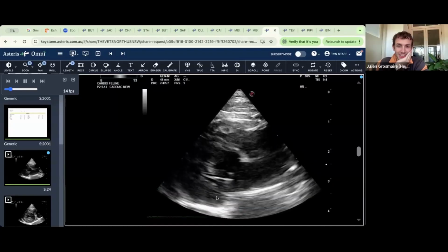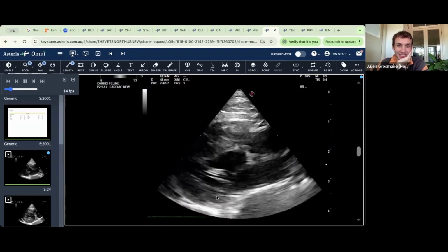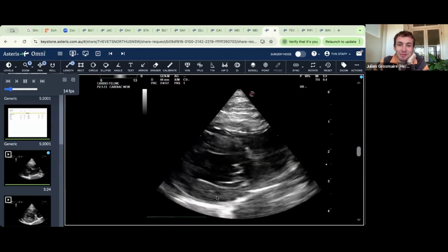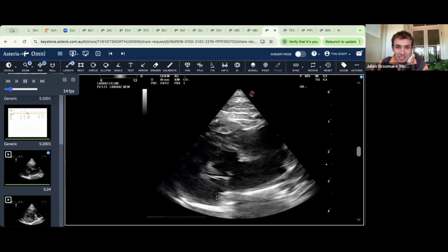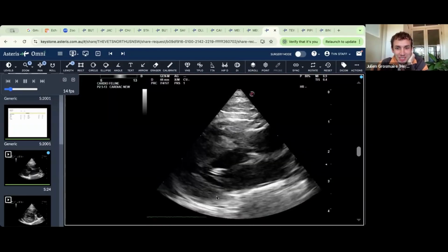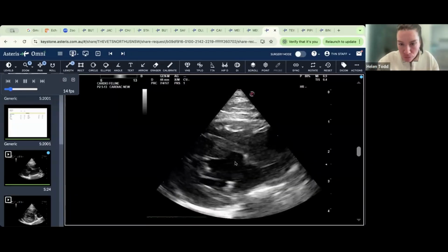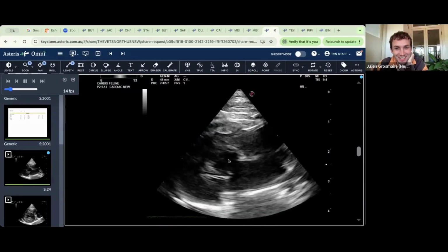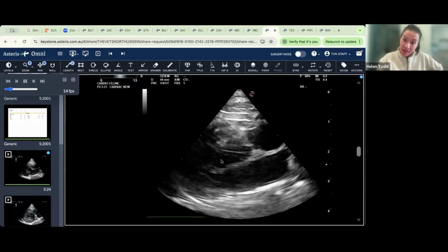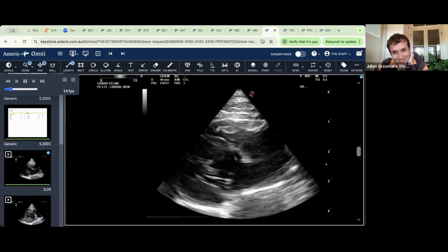It's almost like, is there... no, I feel like I'm interpreting, but is it an outflow obstruction or something where it just seems like it doesn't fully collapse down when the ventricle contracts? Like it seems like it comes back, maybe. As in, there's still a large black space there in the middle. You mean here? Yeah. That's my terrible echoing. That's because I'm going into a bit of a five-chamber view and getting the left ventricular outflow tract in, which is coming up here to the aorta.